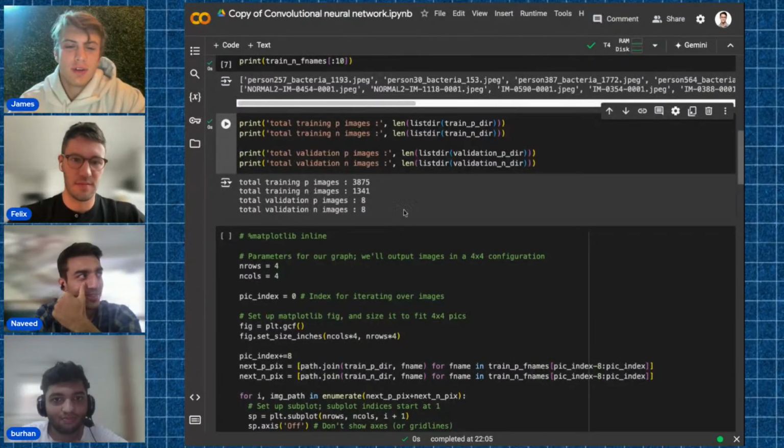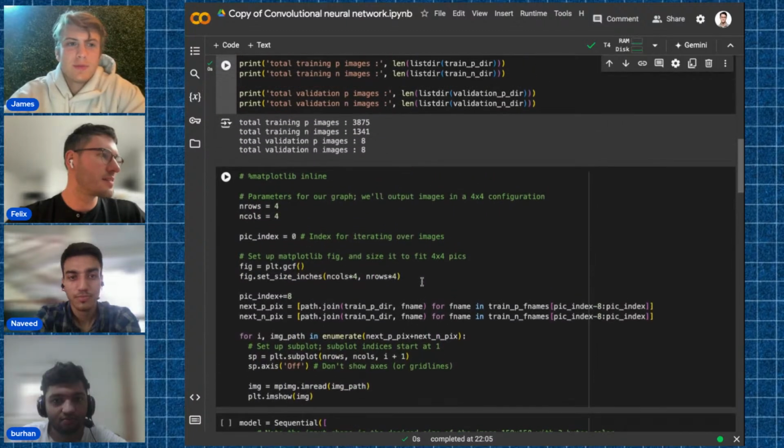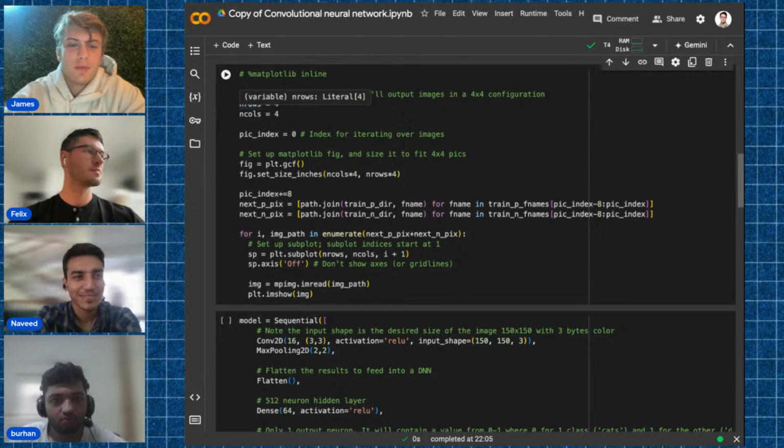Don't worry, it's never going to work on the first round. But yeah, we'll see. Eventually make it work. Yep. So I'm just going to... Oh, you want to introduce something, or should we just go on? Yeah, no, please. Just introduce your project and what's the goal. Oh, okay, next step?